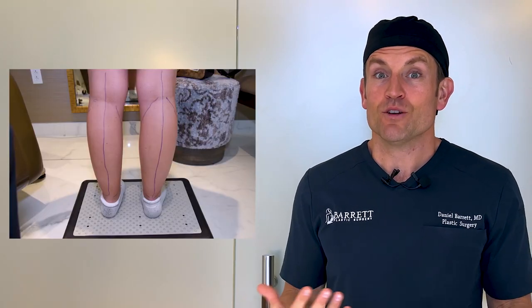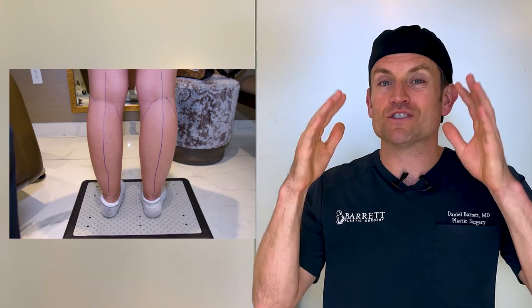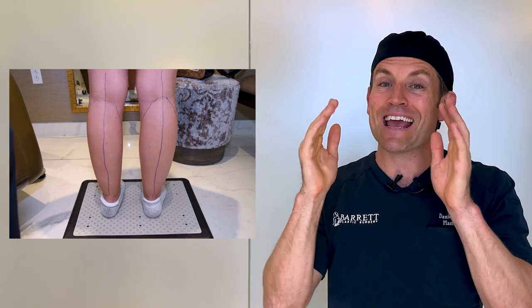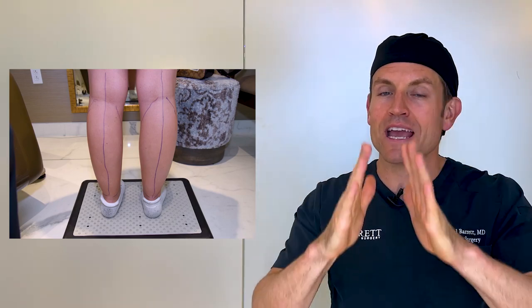Hey everybody, it's Dr. Barrett. How do you get rid of cankles? We're going to show you today. Our patient is 27 years old. We're going to do liposuction of the calves, define them, and the ankle area, and a very careful procedure to highlight the calf-ankle junction. There is a technique for this, and I'm going to show you how it's done, so come on, let's do it.